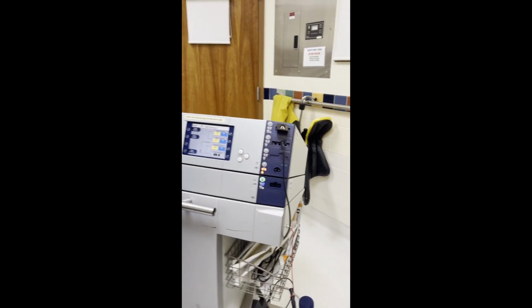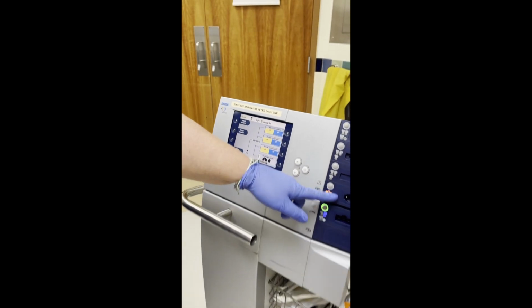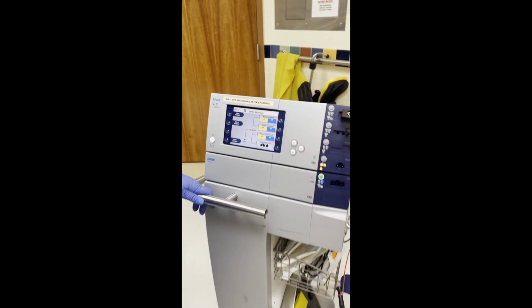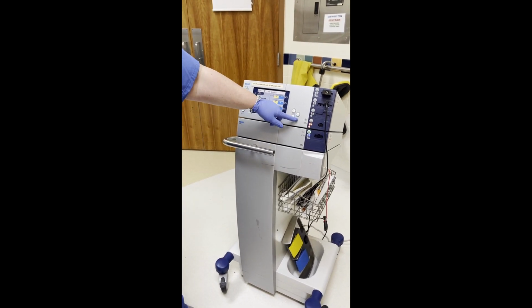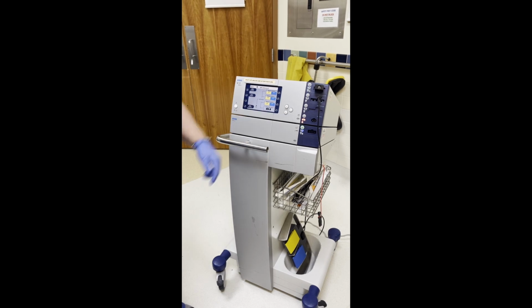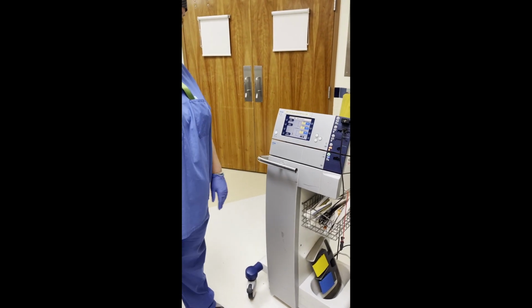All right, and we'll probably show this later, but the grounding pad that you use is just standard Covidien, same as what we use in the OR. Yep, and it goes right there. My only question was, what does this button do? That, I don't know. I think it's for configuring these, but the ERBE representatives came in and set everything. So I think that makes sense, some kind of a configuration. But in all my years, I haven't messed with it, so we'll just pretend like that's not there. That's a good question, huh?